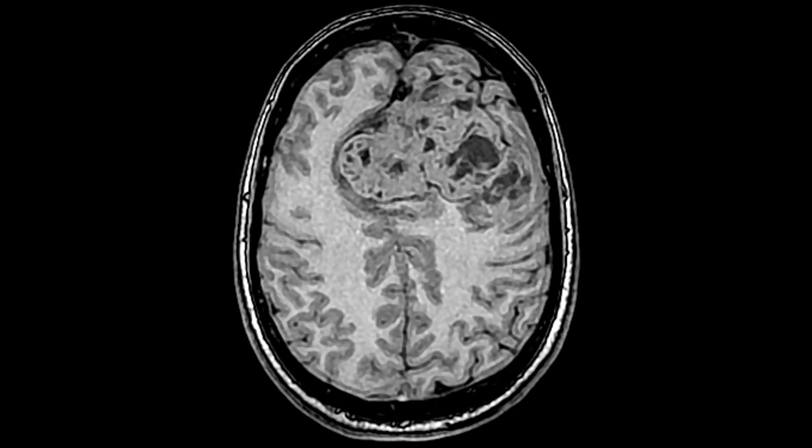All right, when you say out of the parenchyma, that would probably be on the left side low. But if you look at the part that's crossing the midline over to the right side, can you see the cortical ribbon, how it's being displaced, being pushed away? Yeah. That speaks to an extra-axial mass. So this actually is an extra-axial mass. Okay? So within that context, what's the differential?